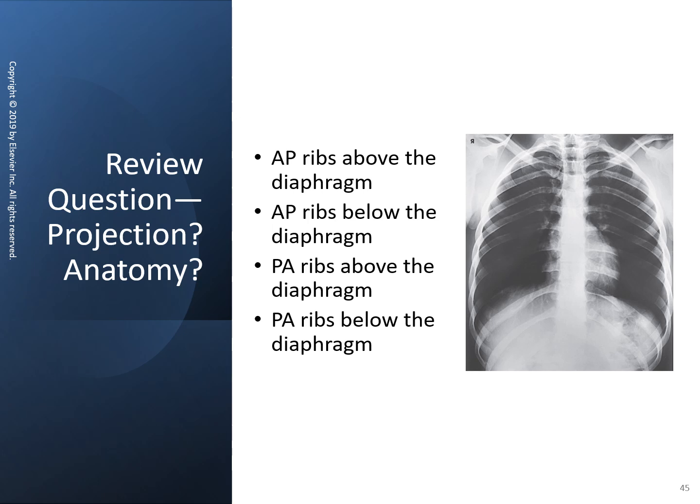But yeah, I still say that the edge of the posterior rib looks a little fuzzy, but the edge of the anterior rib looks nice and sharp. And the letter marker's reversed, so that would indicate PA as well. But I'll show you in image critique the difference between an AP projection of the rib cage and a PA projection of the rib cage, if we can even find an example of a PA projection of the rib cage.